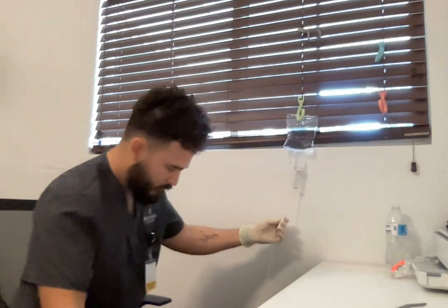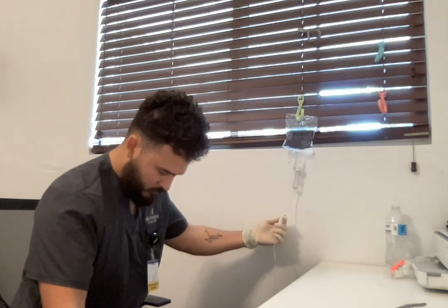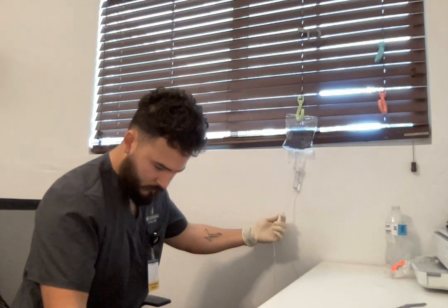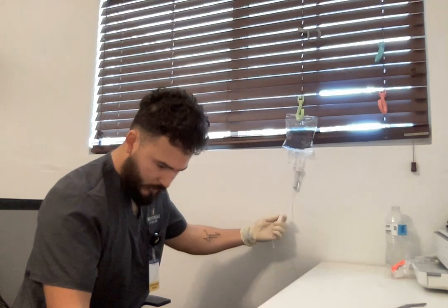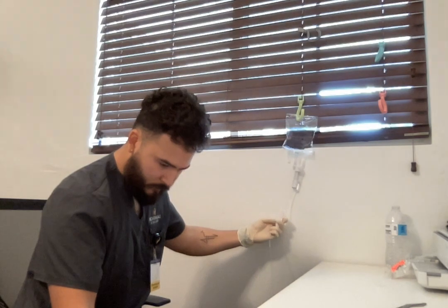Okay, I see it's flowing, getting all the air bubbles out. All right, got air bubbles coming out, and I now have some drops. So I'm gonna fully clamp it again.